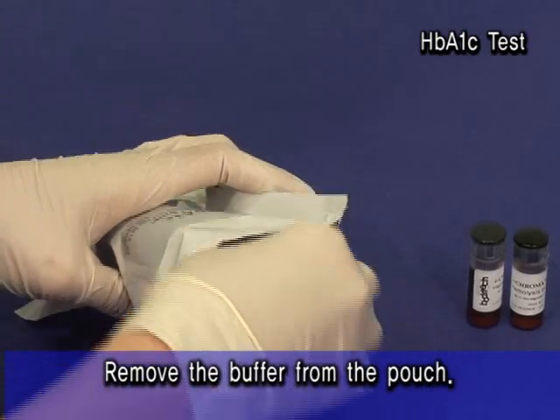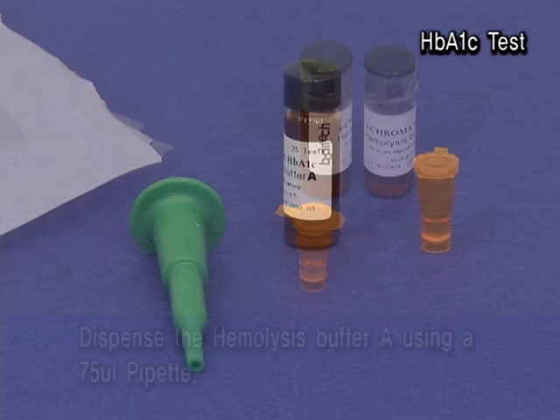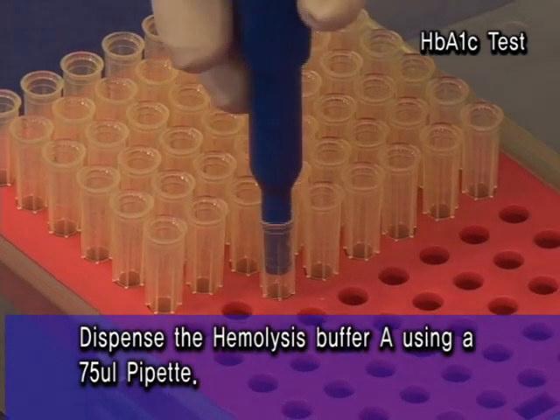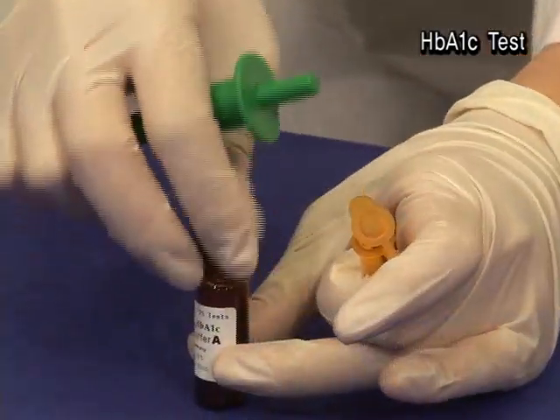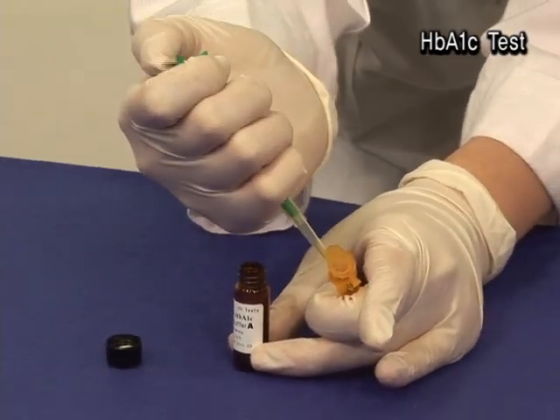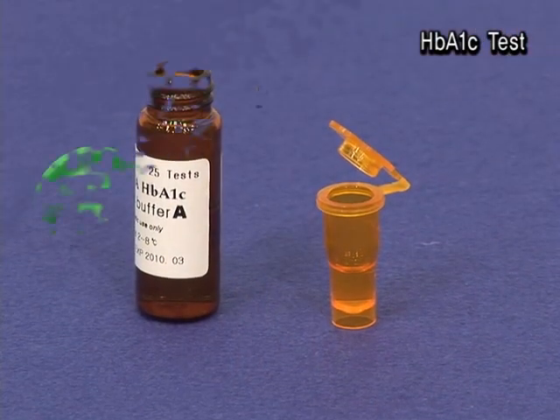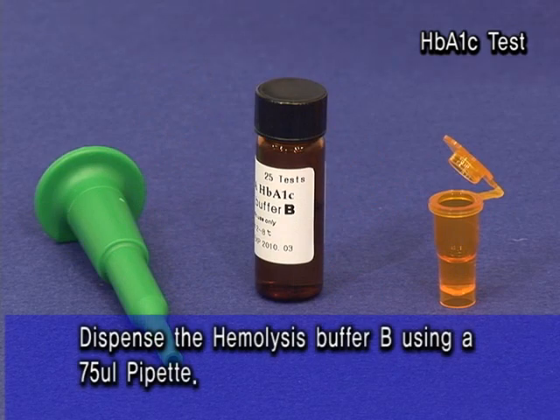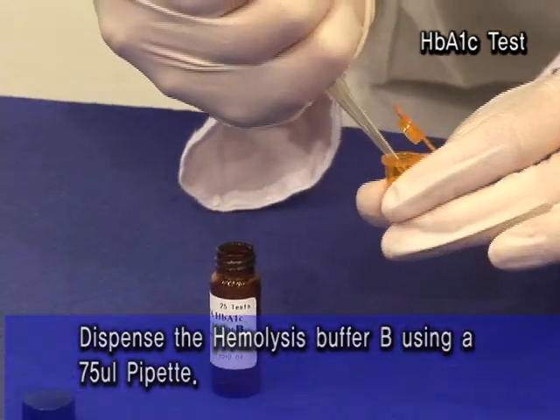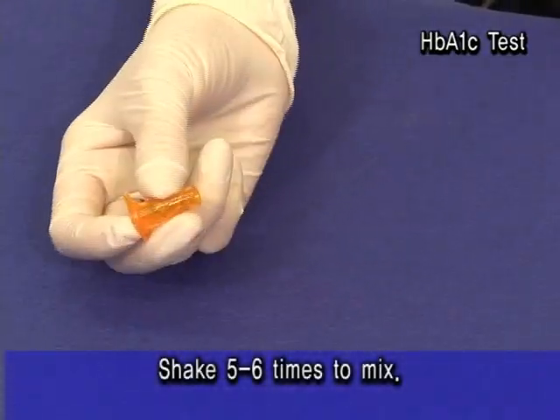Remove the buffer from the pouch. Dispense the hemolysis buffer A using a 75 UL pipette. Dispense the hemolysis buffer B using a 75 UL pipette. Shake 5-6 times to mix.